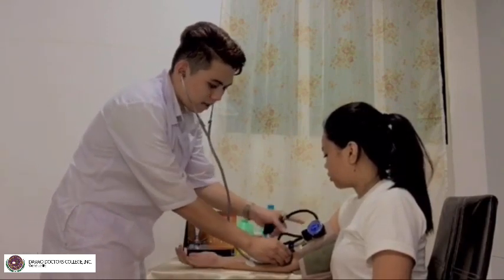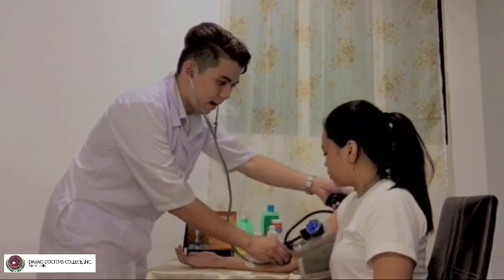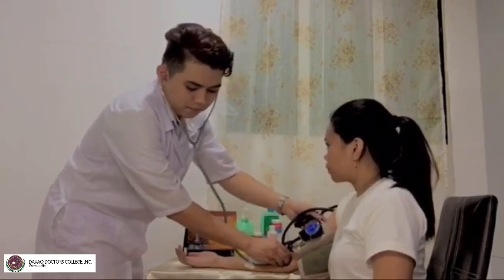So, wala may cloth diri, ma'am. Okay lang ka? Okay lang. O, imong legs, ma'am. Okay lang?